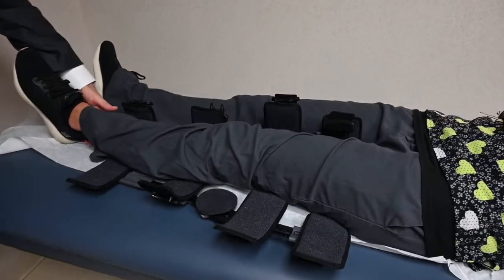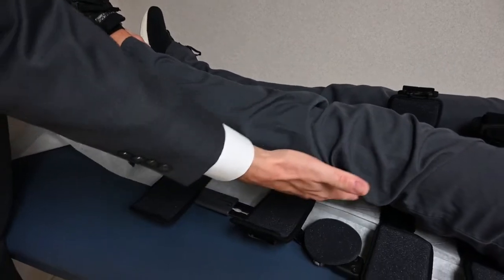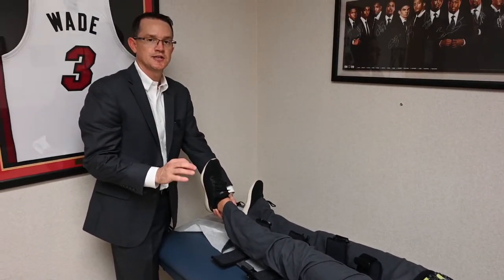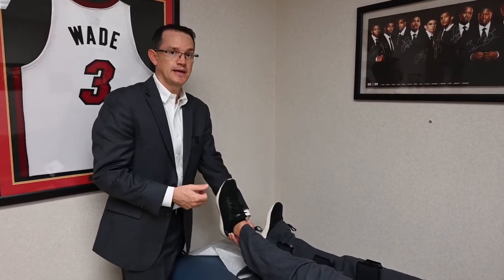Then we want to get a pillow or something up underneath your heel or your foot with nothing under your knee, to allow gravity to straighten that knee out straight. I stress this so much to patients because this is the position that causes a lot of pain and no patients want to voluntarily place the knee in this position. But it is much easier to keep the knee straight from the beginning than it is to try to get the knee straight later on after the pain subsides. I recommend doing these extension exercises multiple times per day out of the brace for the first week or two following your knee operation.